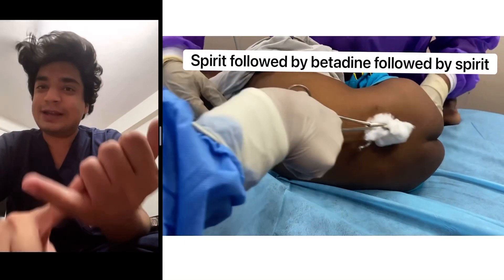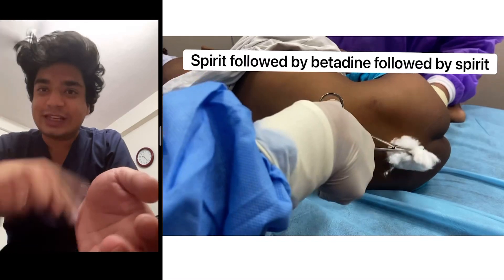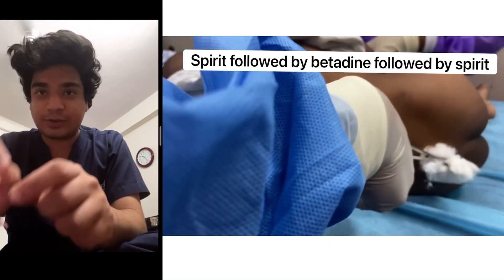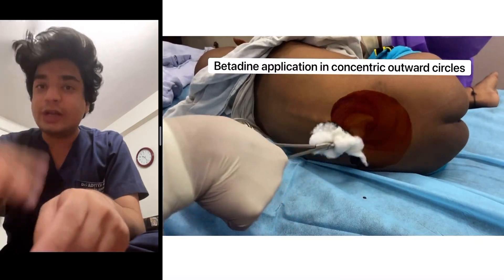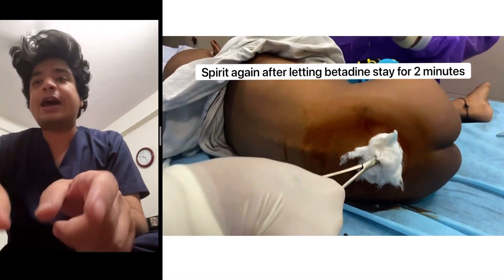First, clean the area where you are going to inject the needle with spirit, then with betadine, always applying it in concentric circles, and then again with spirit.